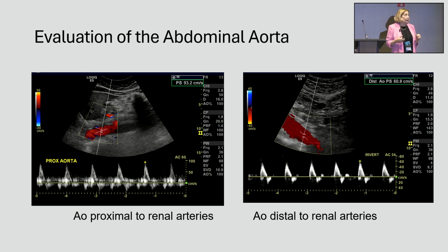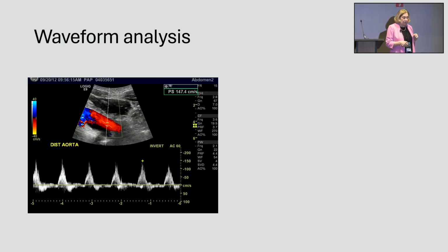Once we get past those low resistance vessels, which would be the celiac and renals, but especially those renals, if the lower extremity vessels have anywhere near their normal resistance, you're going to see a change in waveform pattern, which means end diastolic and early diastolic flow reversal type patterns.